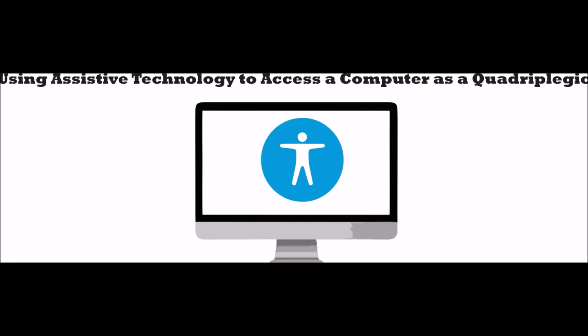In summary, as a quadriplegic, you can use the computer with the help of various software and hardware tools. You can use Dragon Professional Individual 15.0 for typing and creating custom commands, a USB optical mouse or Bluetooth mouse built into your power wheelchair for controlling the mouse cursor, virtual keyboards for easy access to keyboard shortcuts, and an adaptive switch for playing video games or editing videos. You can also use Natural Reader for text-to-speech functionality and optical character recognition to read PDFs, websites, and even images of text. These tools can help make your computer use more accessible and efficient.